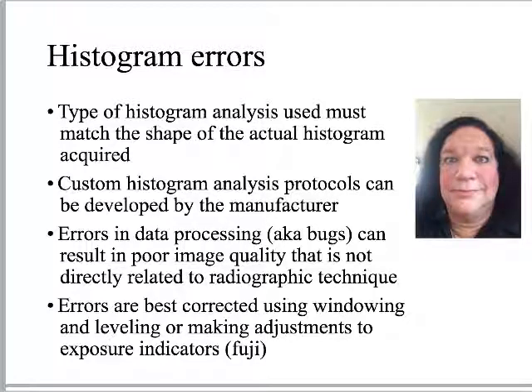Okay? So occasionally there are custom histograms that are developed by the manufacturer and they send out a software update and it allows for errors to be corrected, right? Most of us, if you're working on a CR system, sorry, but you're pretty much out of luck. I imagine a lot of those operating systems are just going to be phased out and they'll stop sending those updates, right? For the people in radiation therapy, you will probably continue to get updates. Whenever they do software updates, that's part of the package that they're sending you, is they're correcting for errors that have been seen in portal imaging. There can be bugs, right, that just result in a poor image.